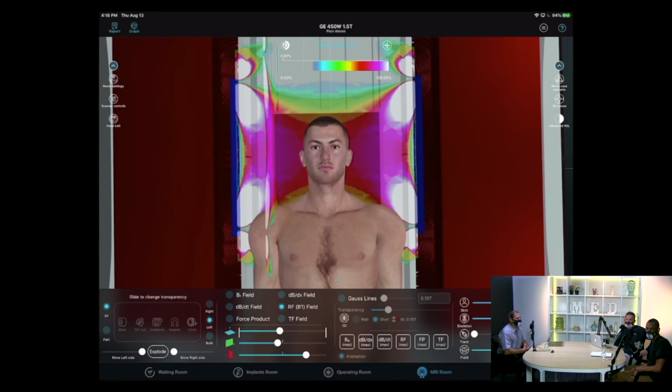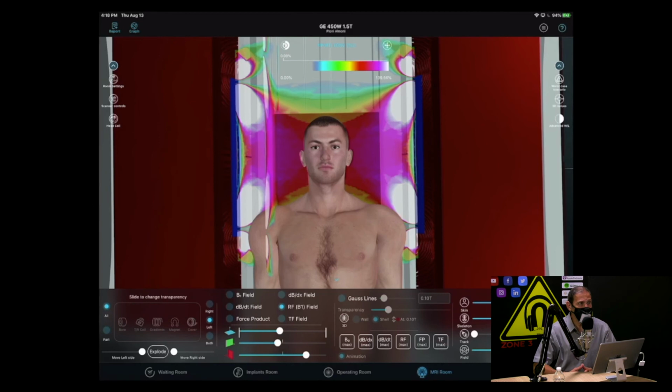With one picture, you instantly can explain to the technologist why you have to take padding seriously. I'm scanning a head. I can get a third-degree burn on the shoulder. What are you talking about? Right. Do that with a CT scan. Right. That's the whole point we're trying to say.